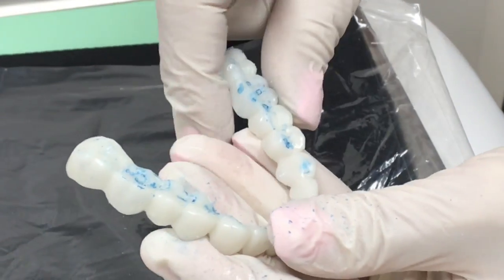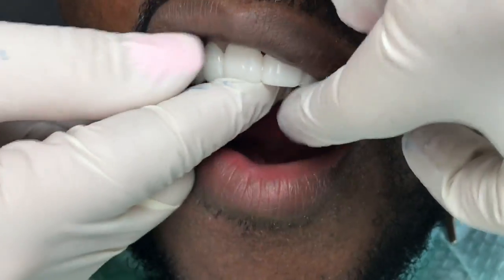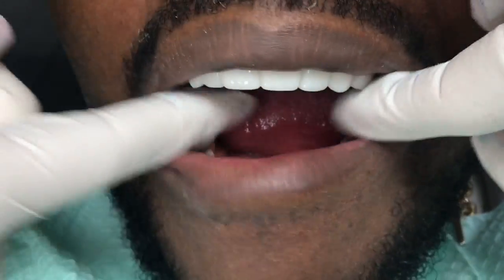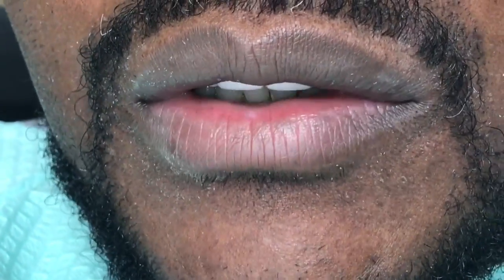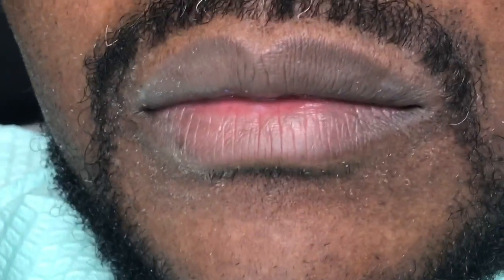We're going to try it again, and we're going to ask him how it feels. So adjusting the appliance is an incredibly important part of this procedure. You want the patients, when they leave, to be able to eat basically anything, chew, without any soreness. So I'm going to go ahead and try it in, and we're going to check it out again. All right, we're going to go ahead and try it in again. Snaps in, bite down. Where are you hitting first? Does it feel even? Yeah, it's even, but I'm hitting first in the back. Where? In the very back? Okay, so we're going to take it out and adjust it again.